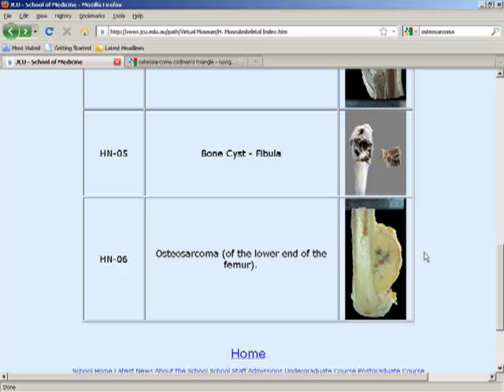Microscopy, only pleomorphic cells with lacy amyloid. Lacy means fine fiber-like amyloid. What is that? Not amyloid. What is that? Lacy osteoid. Osteoid, the precursor of bone, the protein mold.